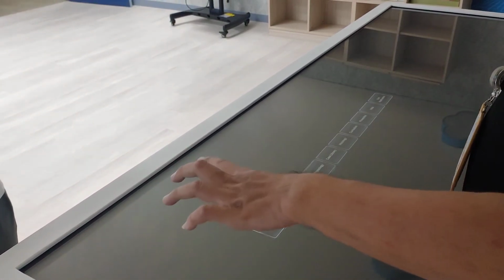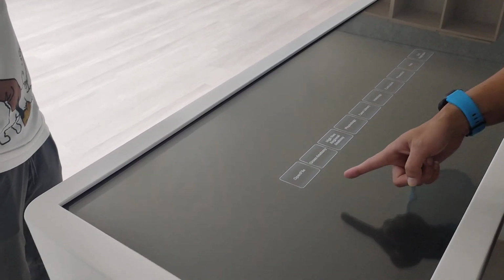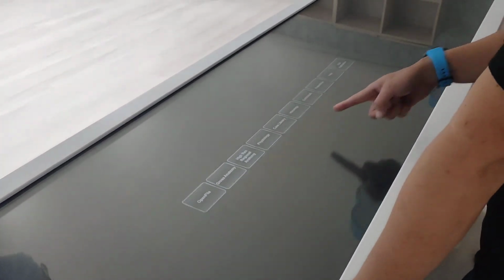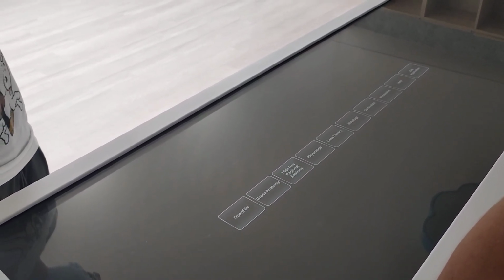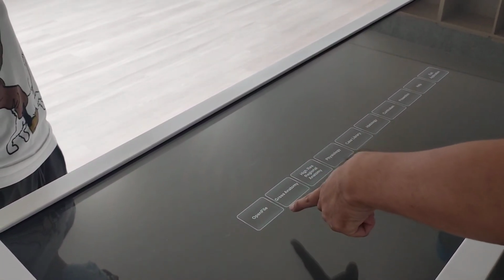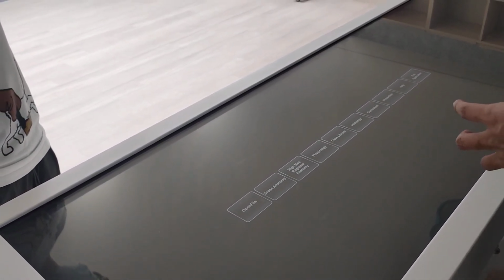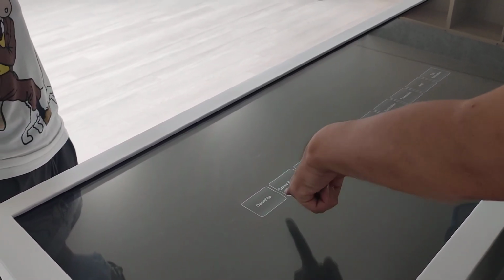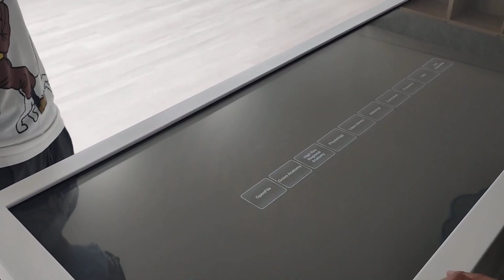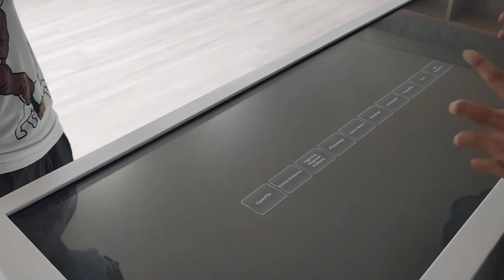If you want to turn on anything, just double click. So you can see this is the tool for turning on the functions of this computer. The open file means if you have CT or MRI images and you want to see them, you can use open file. And this machine is compatible with the machine that the hospital is using to read CT or MRI images.